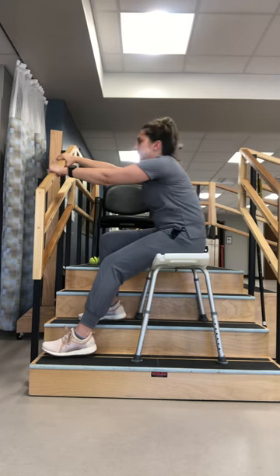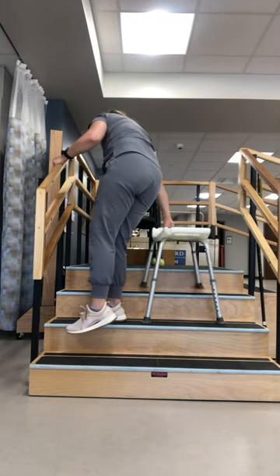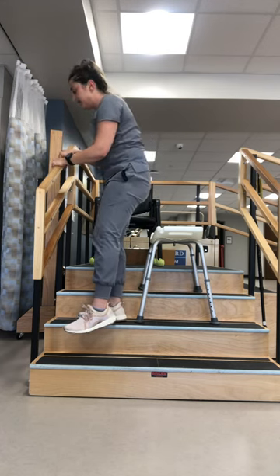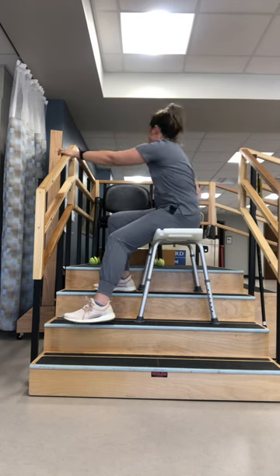Again, I'm going to use both hands on the rail to pull myself up, advance my shower chair one step, use both hands on the rail, and slowly lower. You're going to continue this until you get to the top.